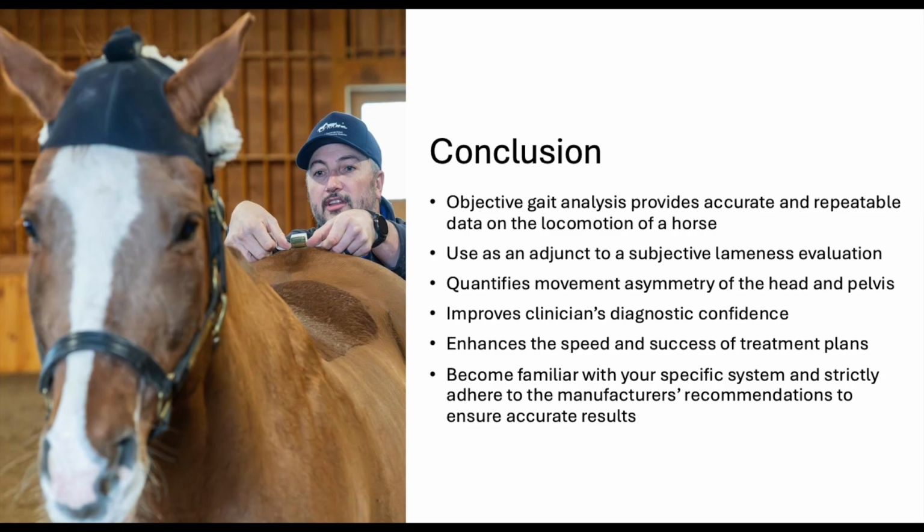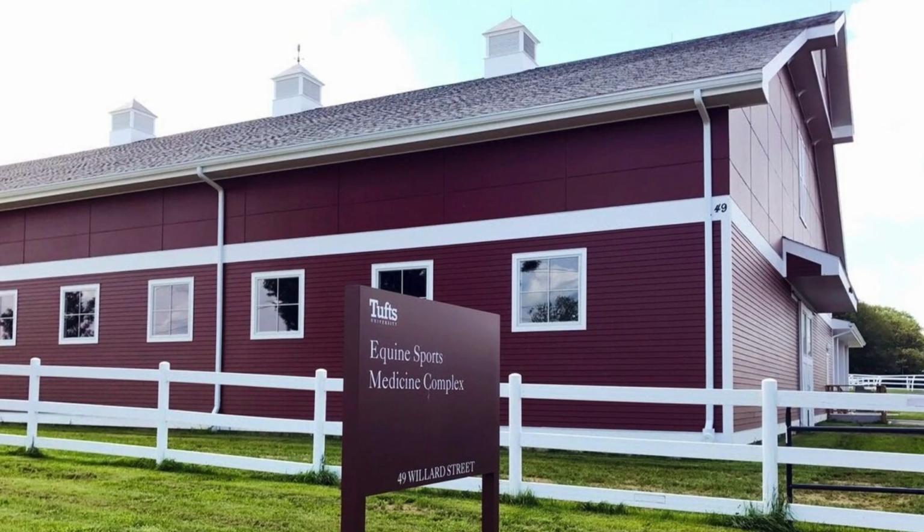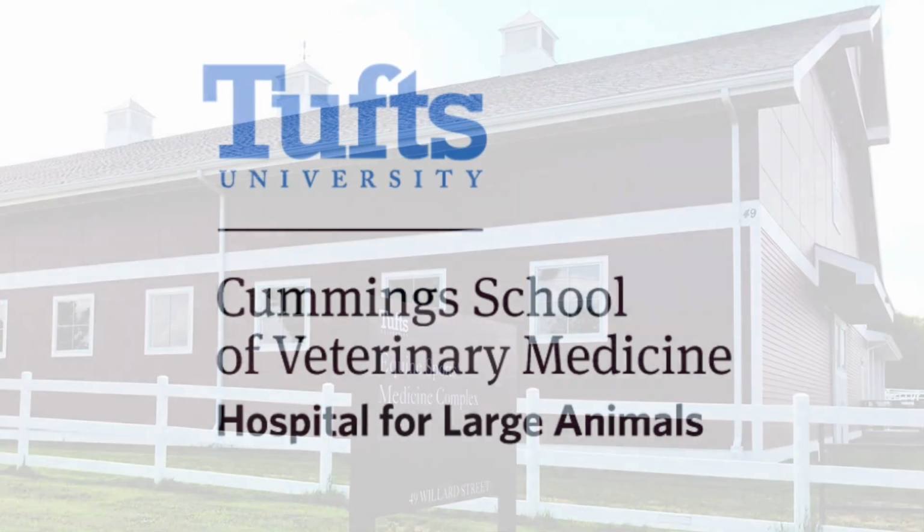However, it is imperative to become familiar with your specific system and strictly adhere to the manufacturer's recommendations to ensure accurate results. This concludes our technical tutorial video on objective gait analysis in the equine patient.